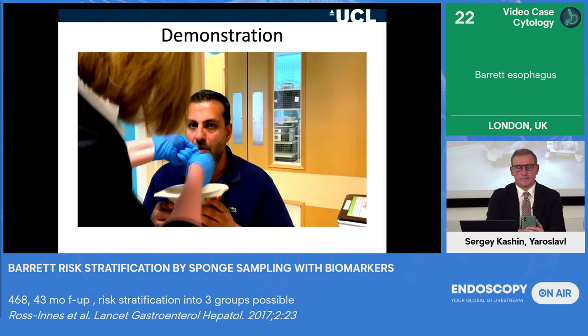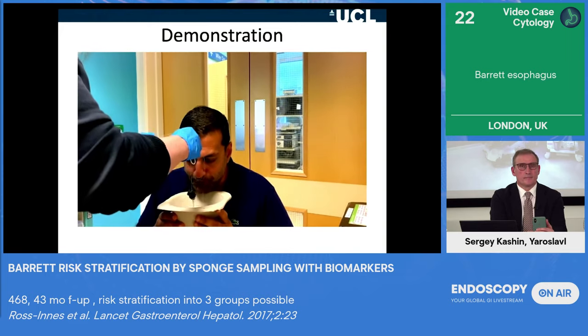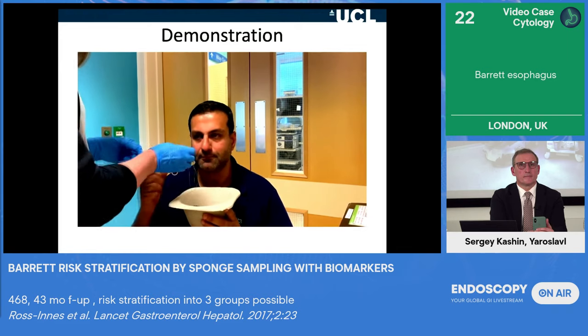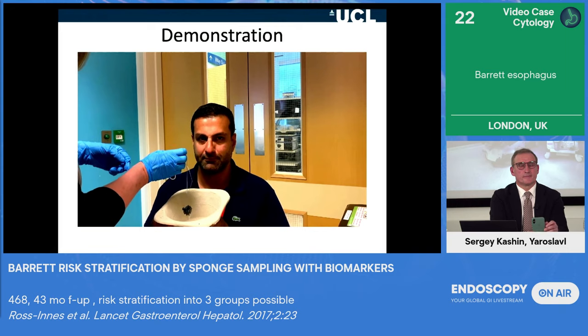And then you can see what Sally's doing here is she is pulling out the capsule, and it's not very aesthetically pleasing for those watching. And there you go, you get a representative sample of cells on that sponge. So we've done about 120 patients at UCH during the COVID lockdown. We've picked up 5 cancers.